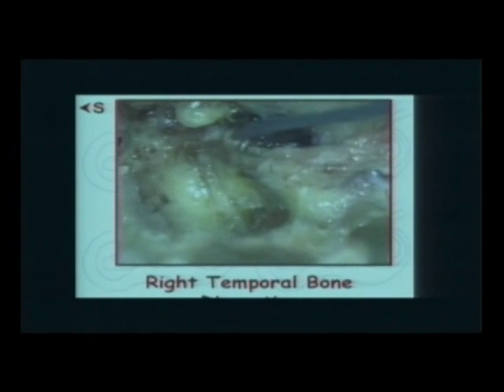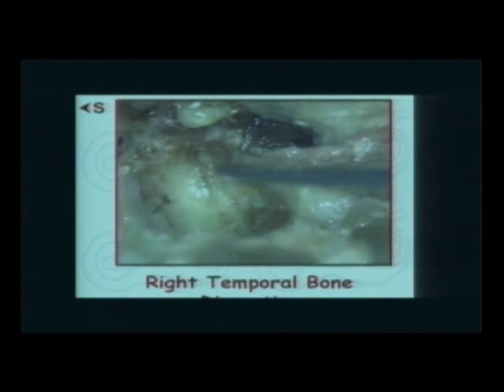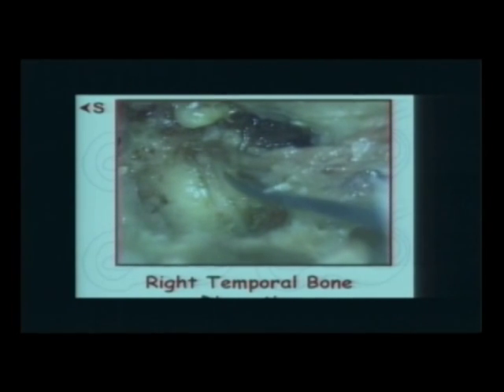You can see the whole facial nerve in this temporal bone and orient yourself. I'm cheating here. What am I doing? I'm getting my microscope and looking from above because I want to show you the cog here. But if I am in the proper position, this labyrinthine segment is behind the tympanic. Just imagine, in the normal position in the patient, the labyrinthine is what? Is behind the tympanic segment. But because I want to show this, I got my microscope tilted a little bit superiorly, looking downwards.